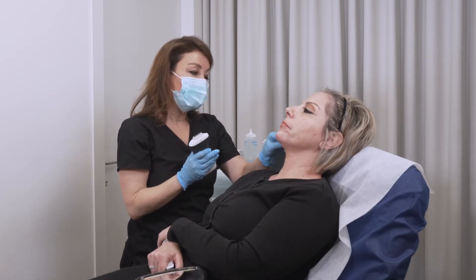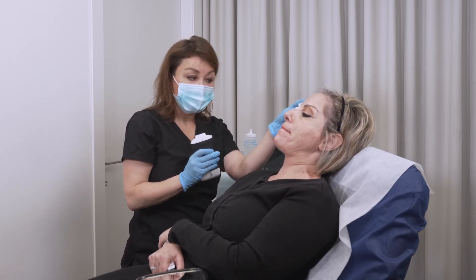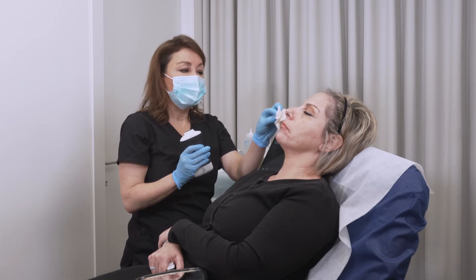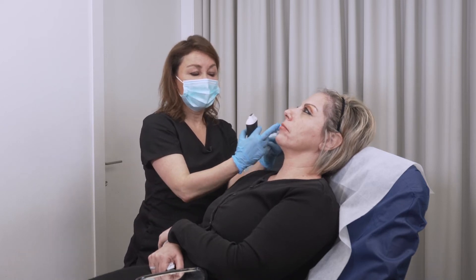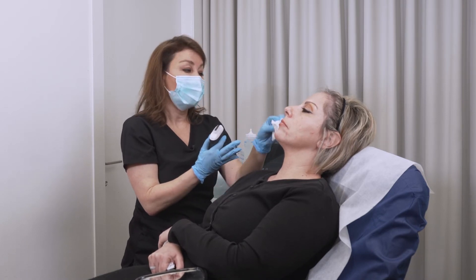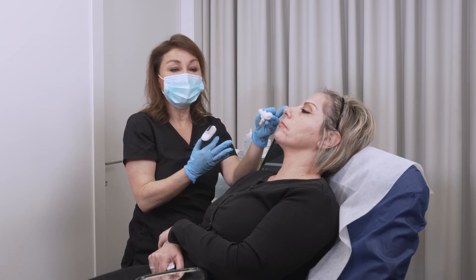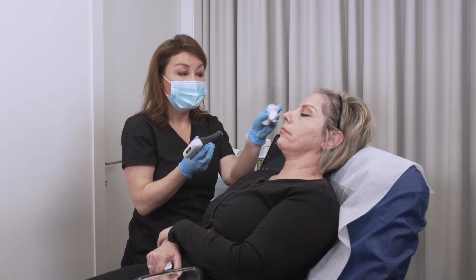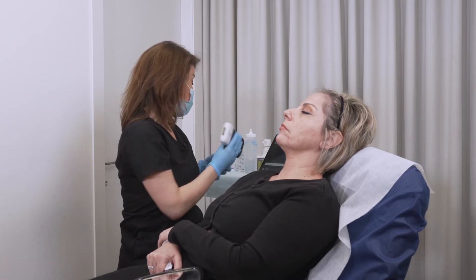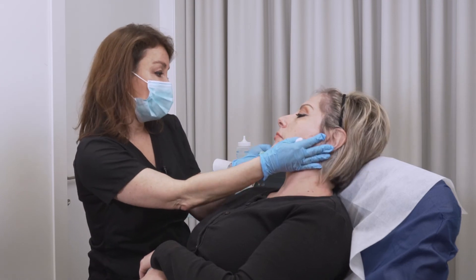So what we can do is inject the lateral sides of her cheek without any risk, because this is not a danger zone — it's a very safe area. But if we want to inject the front side of her cheek, we need to check where the infraorbital artery is. Another artery, the angular artery, is slightly more medial and also needs to be checked if we go closer to the nose. I can now easily inject the lateral sides.